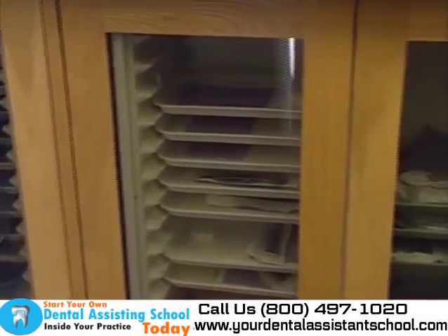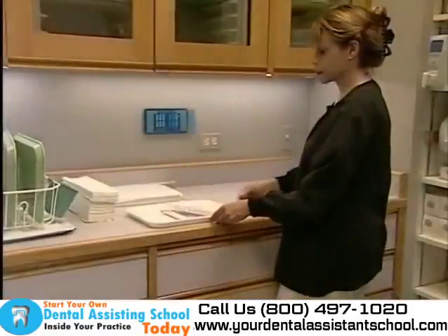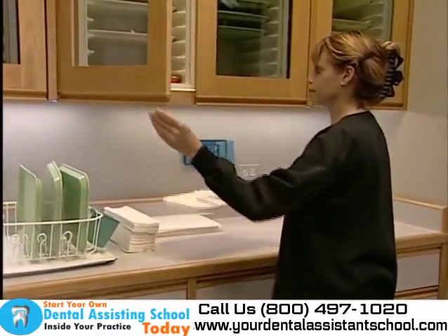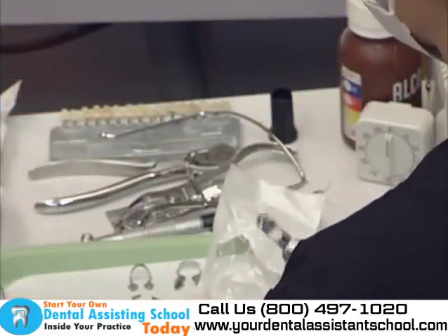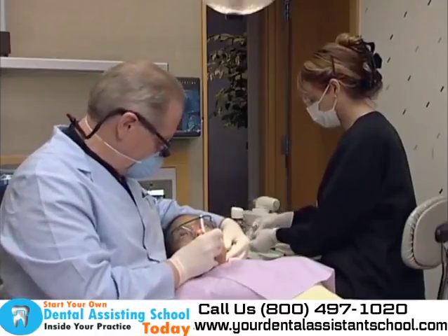Some dentist's offices may use color-coded trays for different setups. The dental assistant presets trays according to specific procedures and places them in special cabinets. Instruments should not be removed from their sterilization bag until just before the patient's procedure is ready to begin.